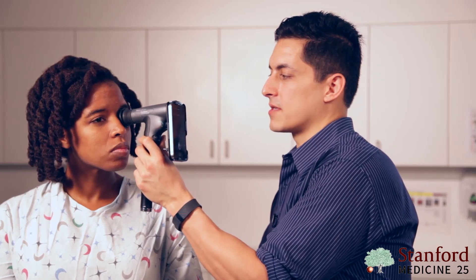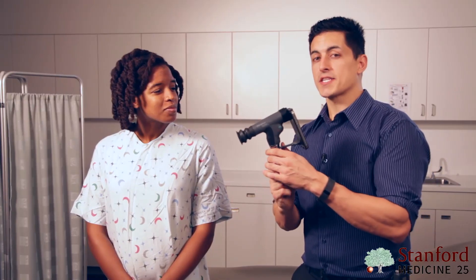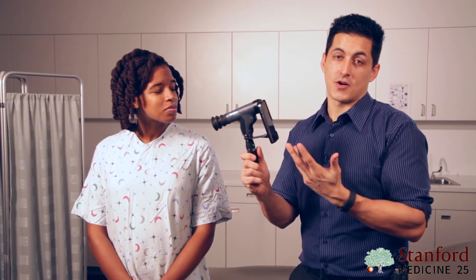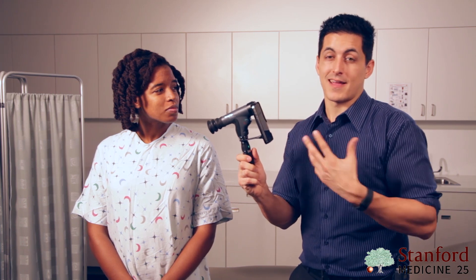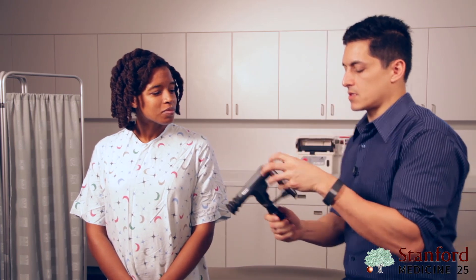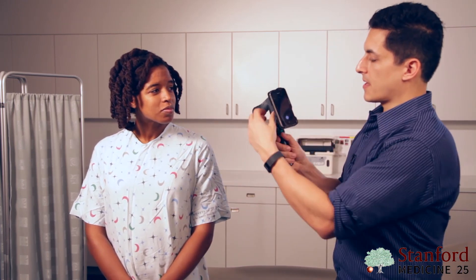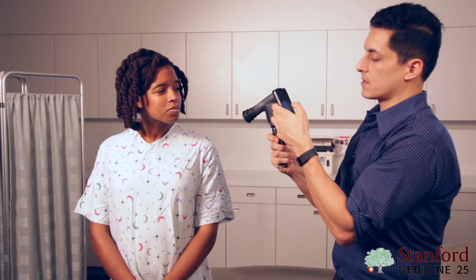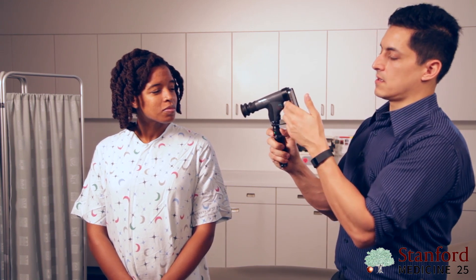We have Jocelyn here and we're going to be examining her eye. The panoptic comes with a little cup that allows you to get as close as you want without worrying about running into the patient's eye. We're going to use an additional adapter called the eye examiner, which allows us to attach an iPhone to the panoptic and take video images or stills of her retina — it's also great for teaching, as you can tell if someone is actually looking at the retina. We turn on the phone, set the scope to zero at the green medium-circle setting, turn on video, and turn on the light.